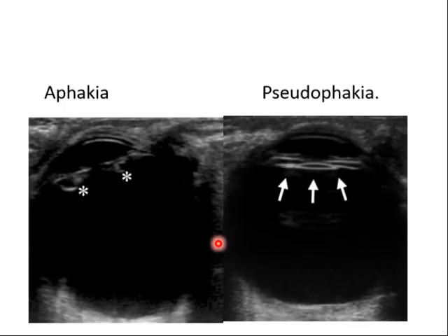And in this case, we have aphakia, when there is absence of the lens. It's called aphakia, no lens. And here it is congenital? Yes, or made after operation. Okay. And here an artificial lens is implanted, called pseudophakia. This is after surgery.